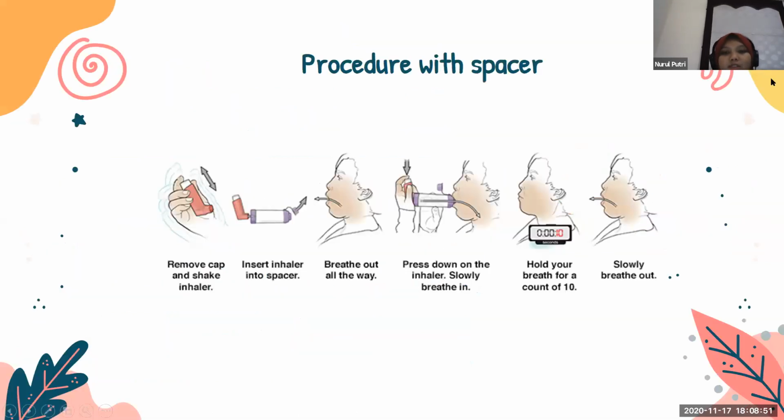Okay, so this is the procedure with a spacer. It is basically the same thing, except for an extra step where you have to insert the inhaler into the spacer and open the mouth cap of the spacer.